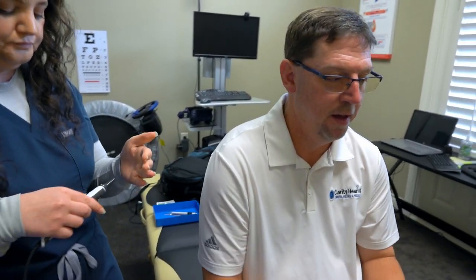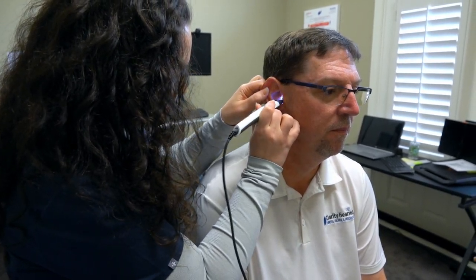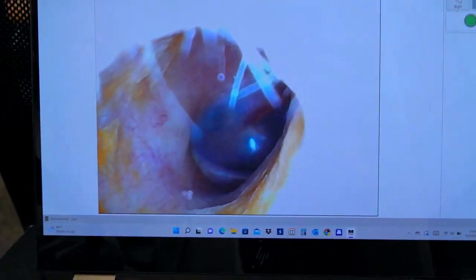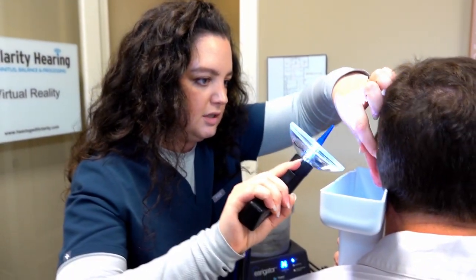Let's take a look and see. Excellent — so now we can see the eardrum clearly. All that wax that was attached to the ear canal is now gone. We are nice and squeaky clean. Now do the other ear. Same thing — if anything's uncomfortable you just let me know.